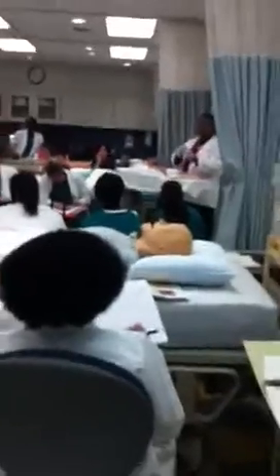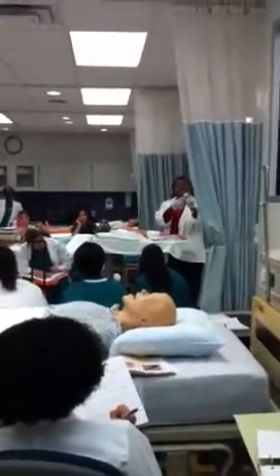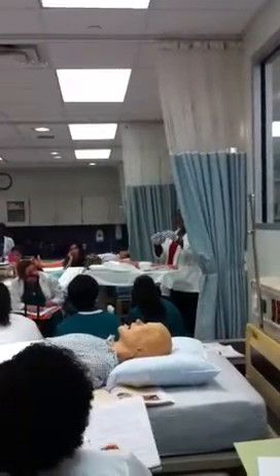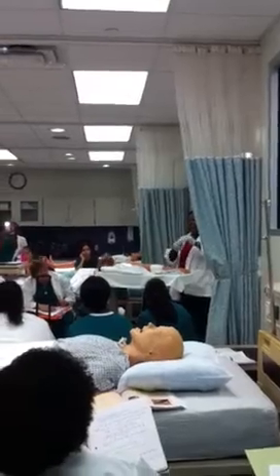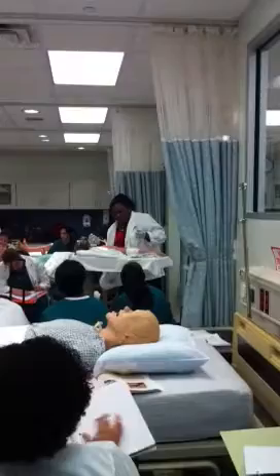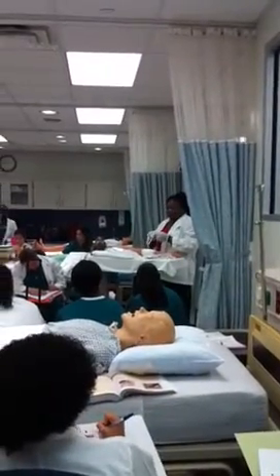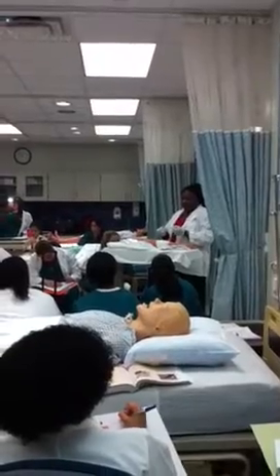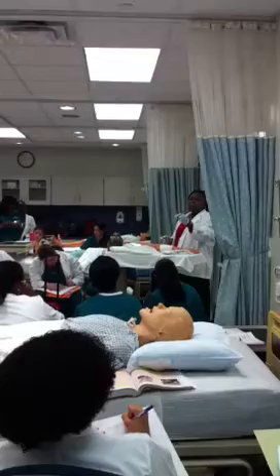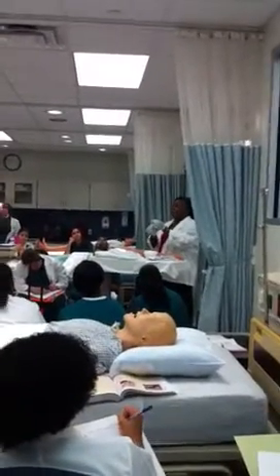Wipe. Guys, wiping is not like this. That's not cleaning. Cleaning, okay, you clean. So I clean. Did I not bring my syringe? Insulin syringe, only for insulin. Don't go grab your regular syringe for insulin. Alright? How many units am I giving? 10. I'll pass this around so you guys can see.